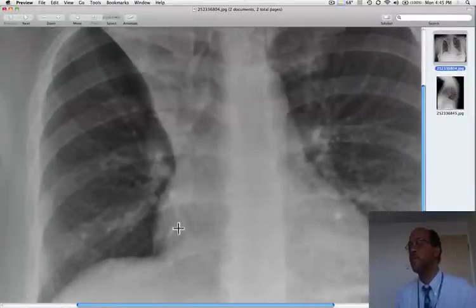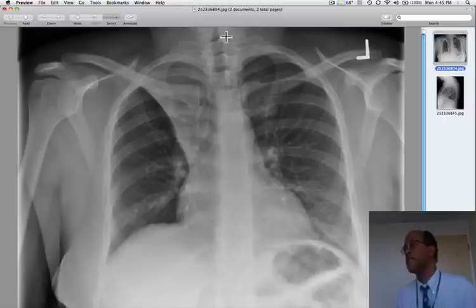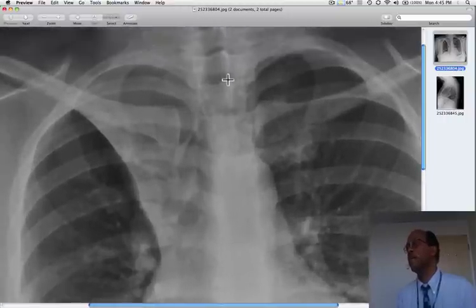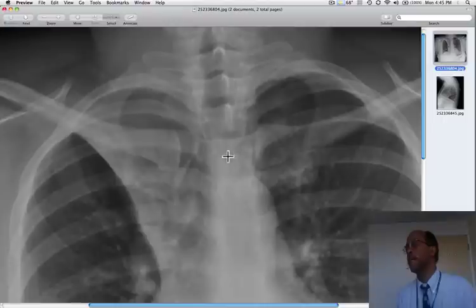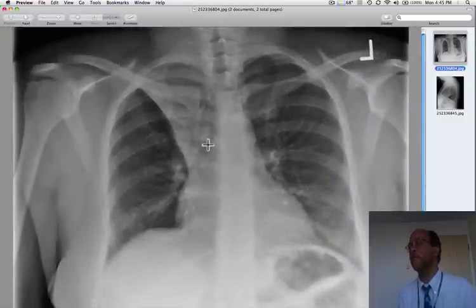That's because there's compensatory hyperinflation of that right lung to match the collapse of the right upper lobe. If you look very carefully, you can see that the trachea, which should be superimposed on the spinous processes, is actually deviated to the right. So these are all great manifestations of right upper lobe collapse.